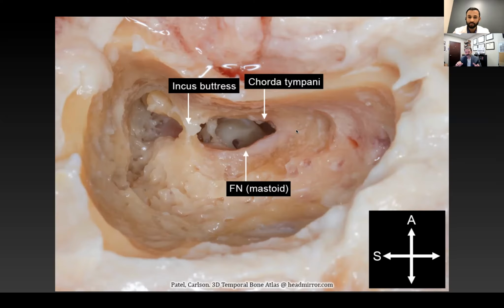If you make an imaginary line from that white dot to the anterior portion of the mastoid tip, it'll always bisect this. In fact, it's just coming out in a paper, but it basically shows anatomically it's very reliable to bisect it. And so I just start drilling in that trajectory, and I keep drilling until I'm drilling through it, and I usually end up seeing the stapes tendon first. And then once I see that, I know exactly where everything is, because, just like I said, that anatomy is all locked in.